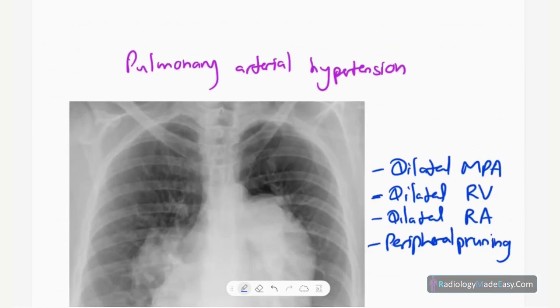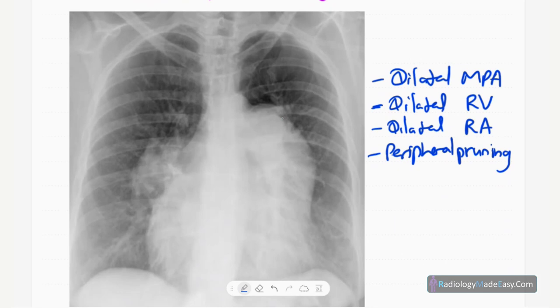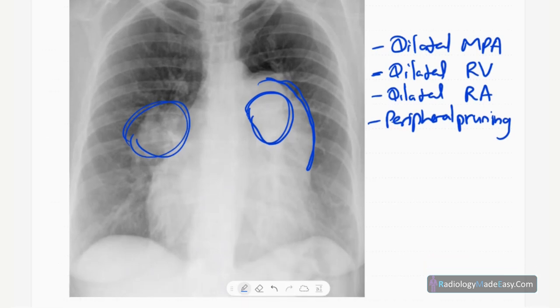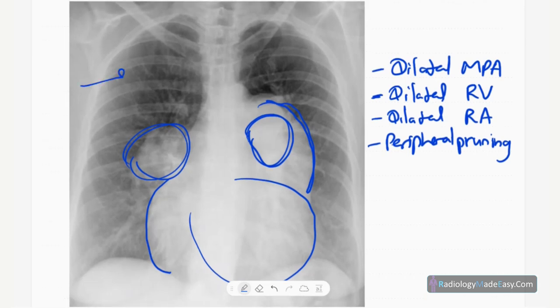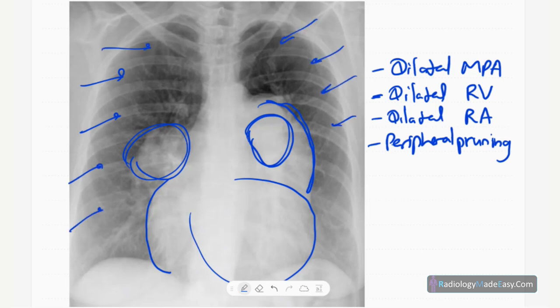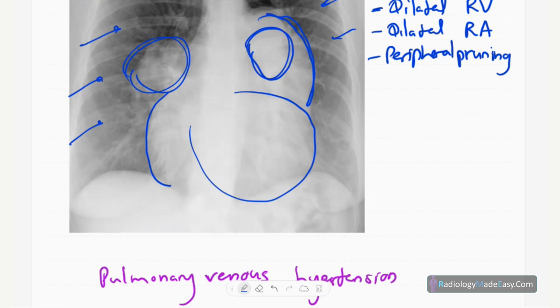Next is pulmonary arterial hypertension. The main pulmonary artery is dilated, as are the right and left pulmonary arteries. There may be a dilated right atrium with a prominent right atrial border, and sometimes right ventricular enlargement. In severe pulmonary arterial hypertension, peripheral pruning occurs — the peripheral vessels are not visible.